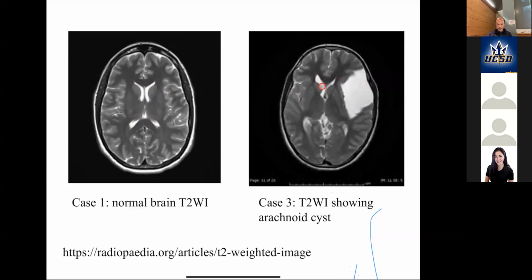This person also has that in the ventricles, but you can see this cyst is actually pressing in. And so this ventricle is deformed here, right? There's a lot of pressure from that cyst pushing onto the tissue. And you can see this is totally filled with fluid.